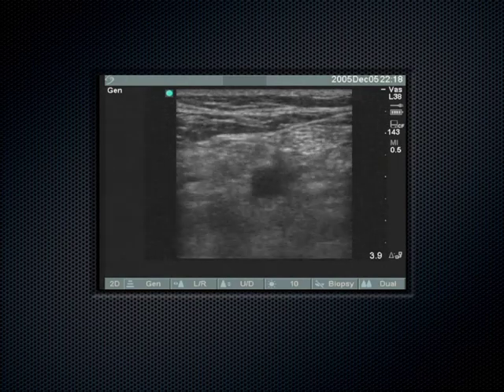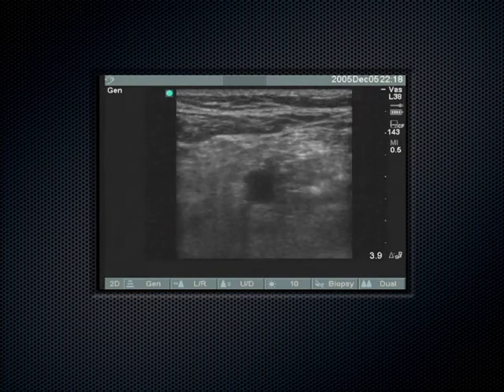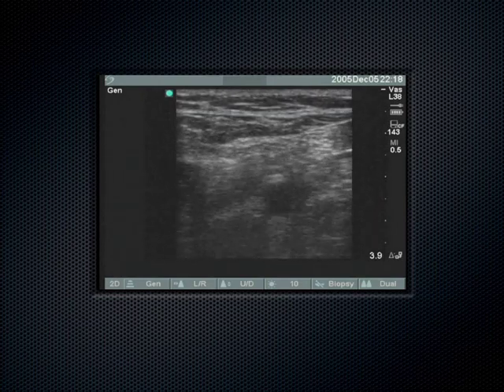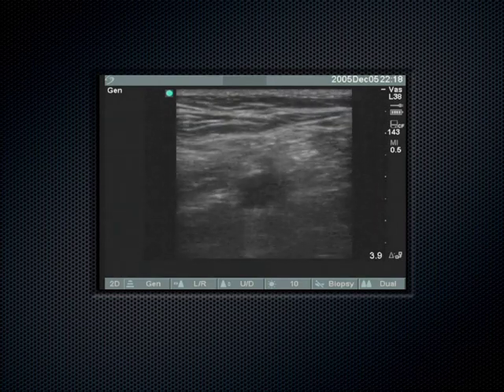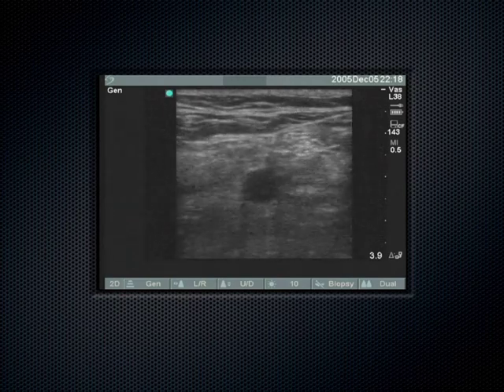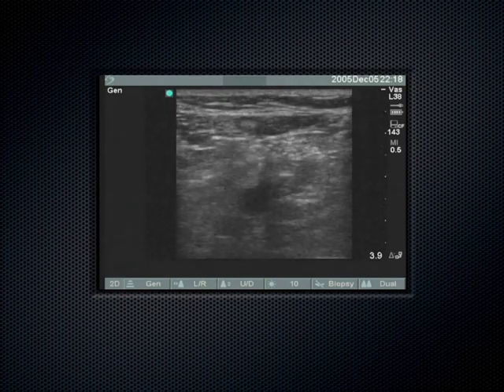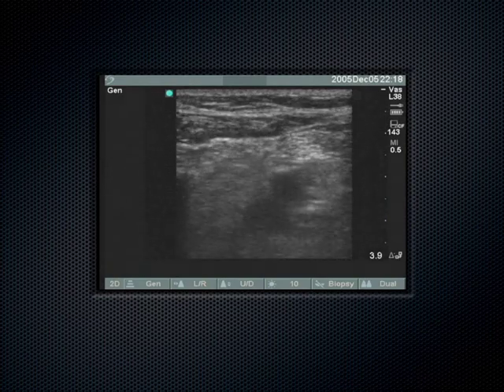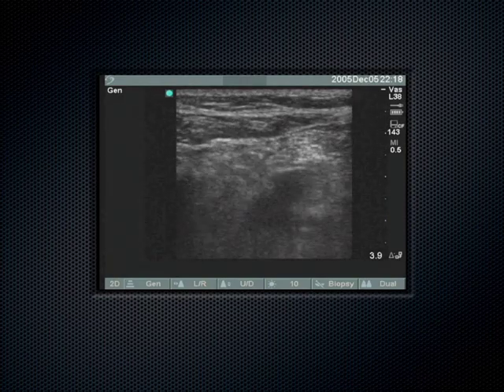Where are we? Hard to know. Turns out, now you know. See that? This kind of gets at the Frank Netter drawing a little bit, actually. Interesting, after I told him that you don't see this. I'm going to pause it when it becomes clear where we are. So we're pushing right there, and then there. So this is the popliteal fossa.